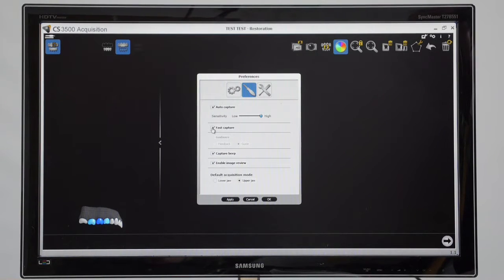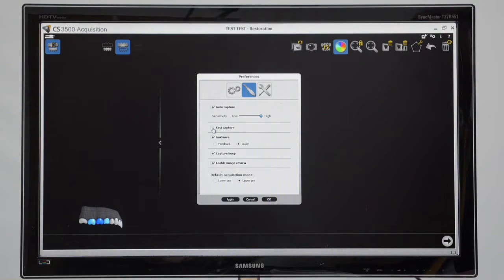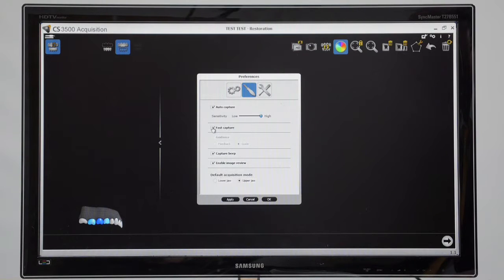Then we have fast capture. You can turn that off. If you find that the capturing is quicker than you're moving around the arch, you can turn that fast capture button on and off.